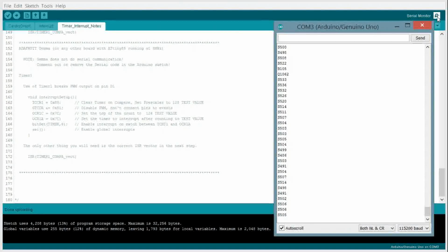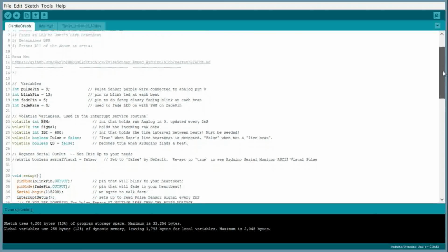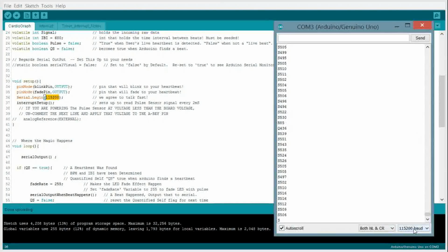And you can kind of see it there. Every now and then it's going to change. And I'll stop this in a second so that you can see what's going on. One of the key things you want to remember here is just to set up your baud rate correctly. Make sure your serial port is set up for the correct baud rate, the one that's being used in the code. And I'll show you. Down here. Right here. All right. You want to make sure those match. If they don't, all this data is going to come out all messed up.